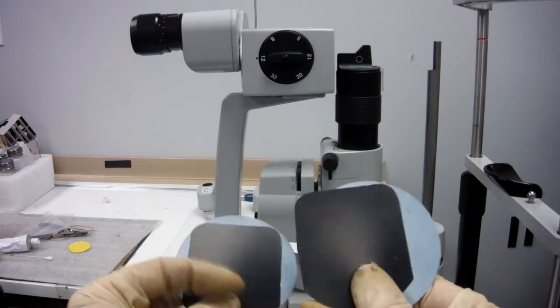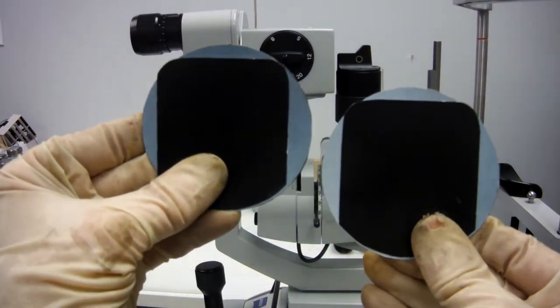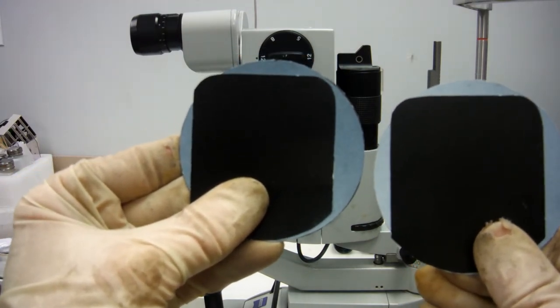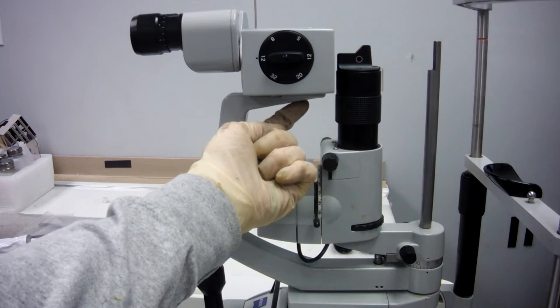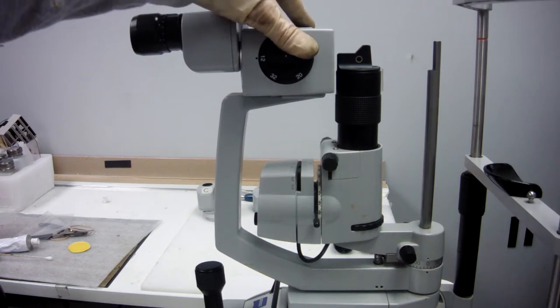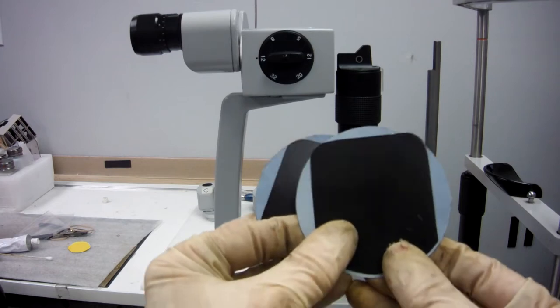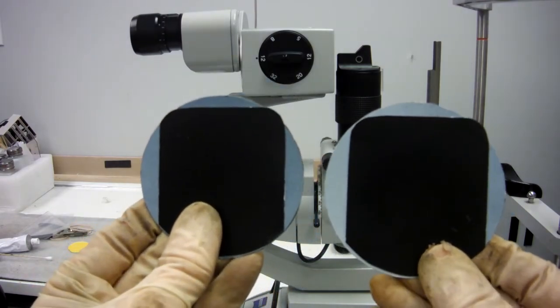Like this. I'd make sure each side had equal space as I was looking through it. If they're both off to one side or the other, then I would know that my head needs to be turned a little bit. Loosen these two Allens and turn the head one way or the other, gently. Be careful that you don't lose your focus this way. You're just turning left and right to get the space on each side of your focus bar to be even in each eye.